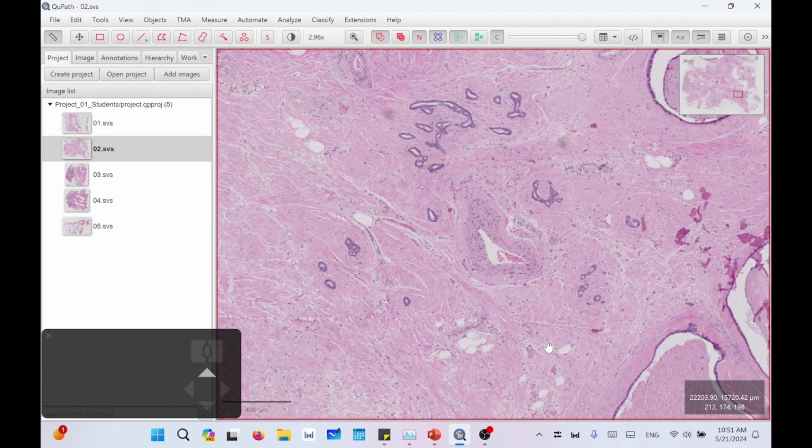Also, we can separate between tumor and non-tumor parts if you are dealing with that, or separate nuclei from the image. Then we can use these annotations to provide later to a classifier that can learn from the patterns of the tumor and the non-tumor, and then when we apply another tile or patch to that classifier, it will predict whether it's a tumor or non-tumor. It can predict the severity of the tumor based on the annotation we are dealing with.